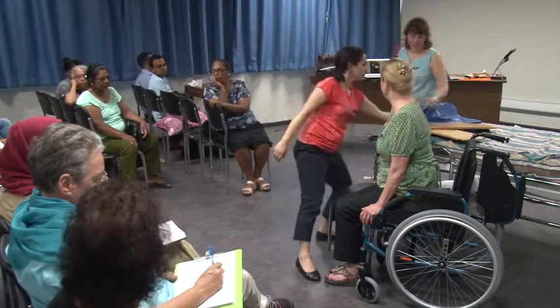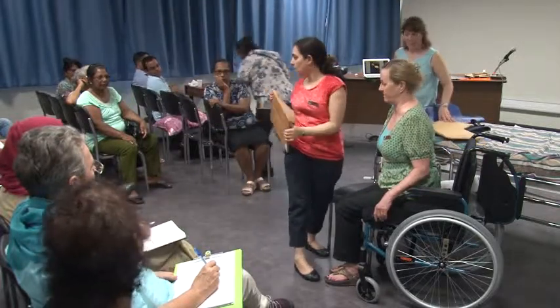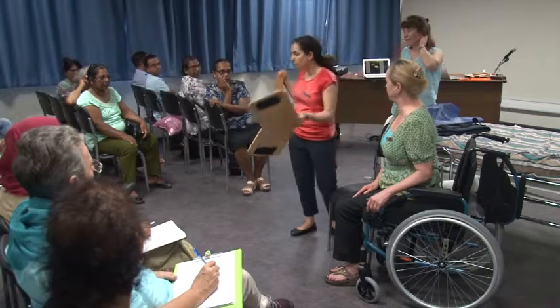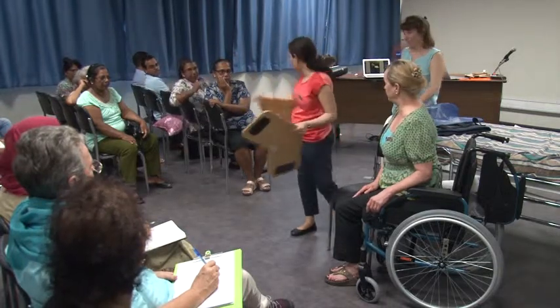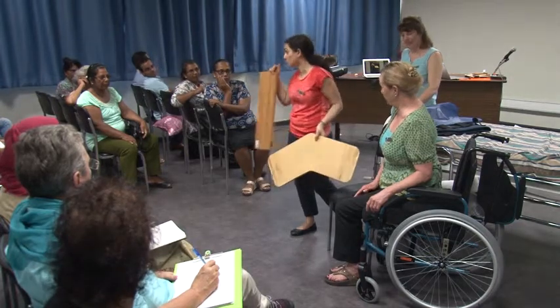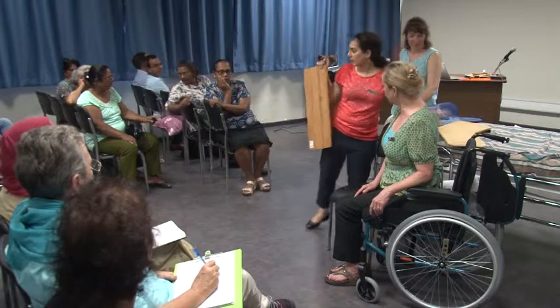And then you could have a straight slide board, or you could have a banana board, which is this. The banana board is slightly longer and it is a curvy one, which will be good for car transfers, toilet, commode chair transfers. You have to make that judgment yourself.